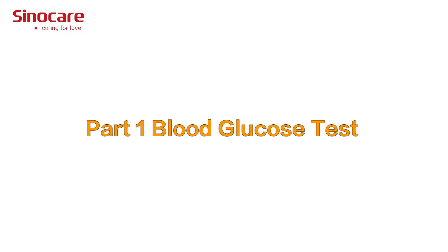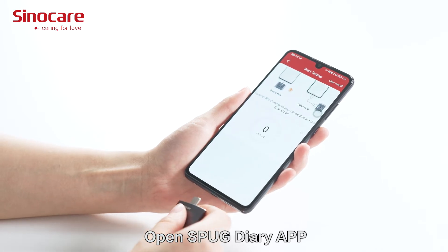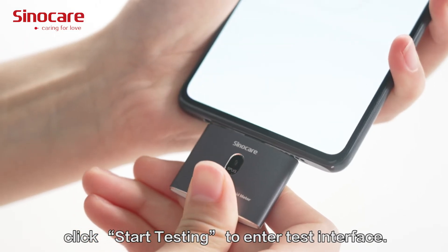Part 1: Blood glucose test. Open the SPUG Diary app and click Start Testing to enter the test interface.